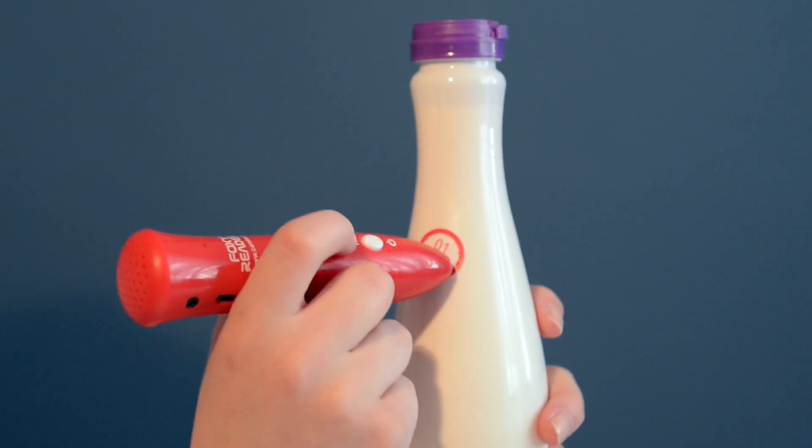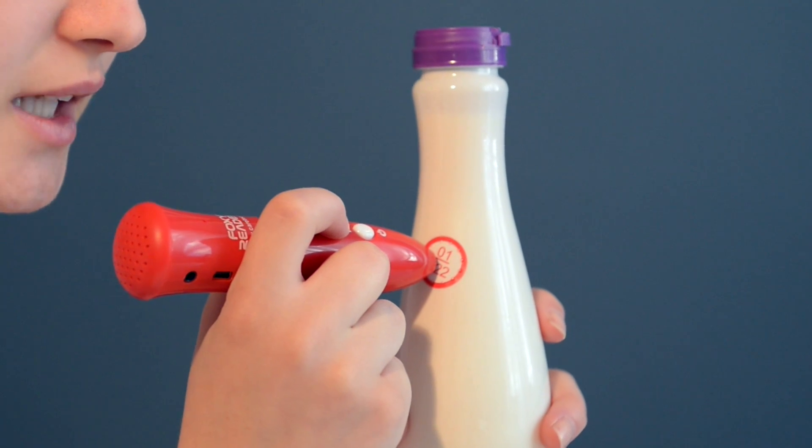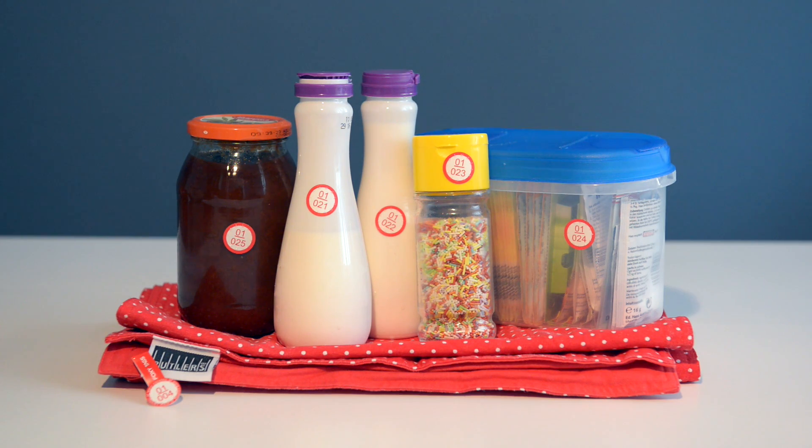Hold down the middle key. Point the Foxy Reader towards the label. Speak the information into the microphone while you hold down the key and release it. This will make organizing and finding things so much easier.